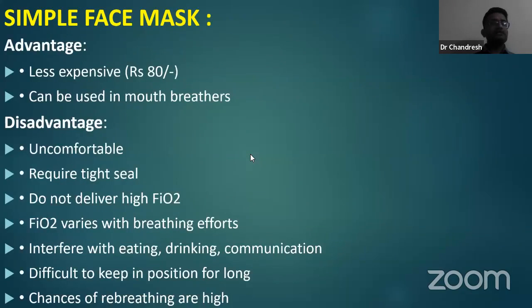Next. Simple face mask. It has an advantage. Yes, definitely it is less expensive. It can be used in the mouth breather also. The disadvantage, yes, because it is continuously covering your nose and mouth, it is uncomfortable.